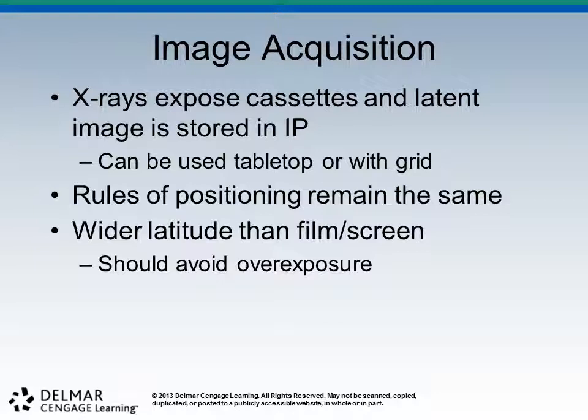Whenever you purchase a PSP cassette, the best thing about them is that they can be used in existing film type equipment. We use them just like film cassettes, but they've got a much wider latitude. I don't think I need to explain that any further. Many more techniques can give us a diagnostic image. But we use them just like we use regular film cassettes. That's a huge deal. So we can spend our money on the cassettes and on the image plate reader and not spend our money on equipment. When we go to DR, we spend a whole lot more money on equipment, but we now can fire a whole bunch of people and save our money that way.